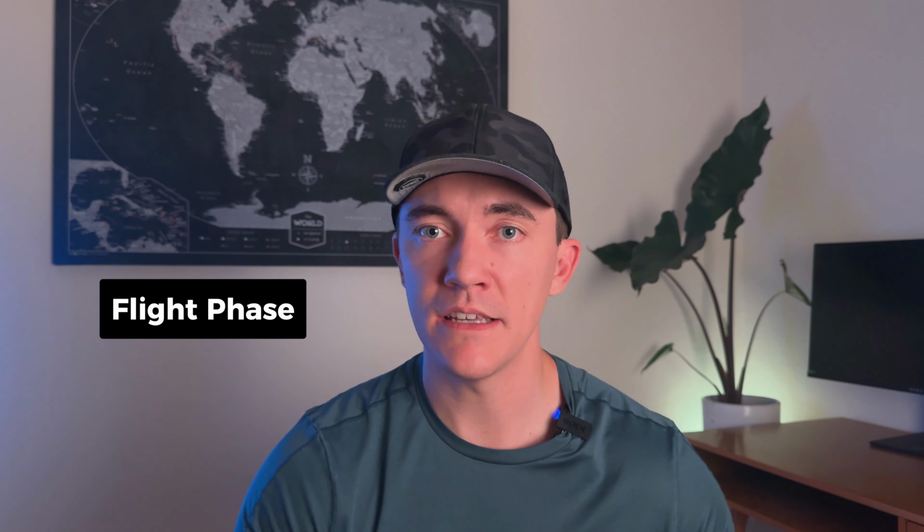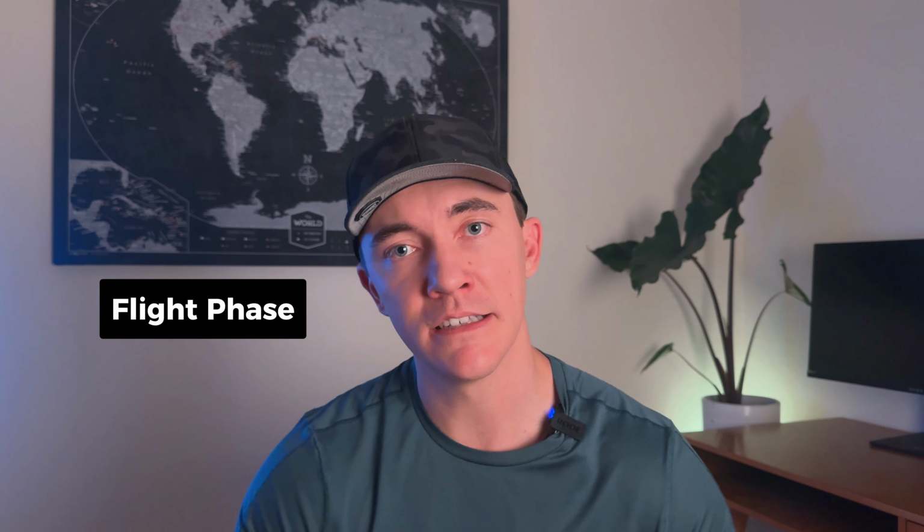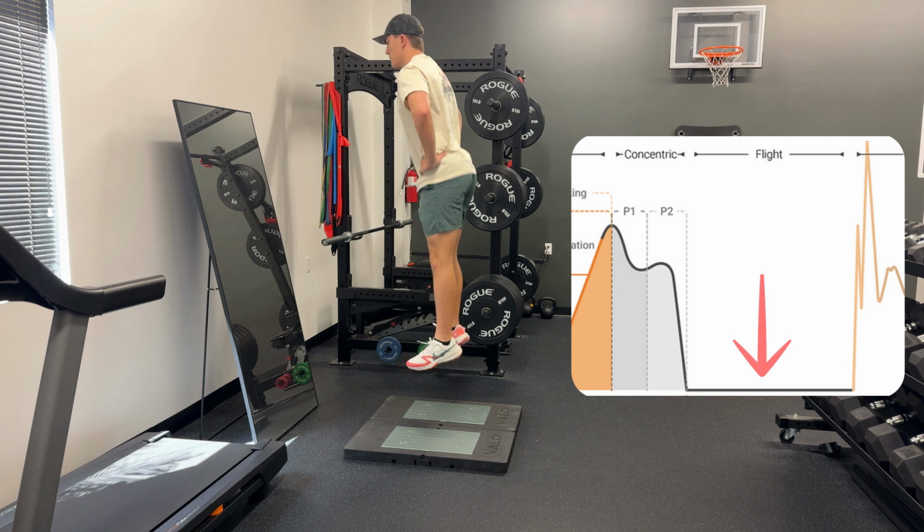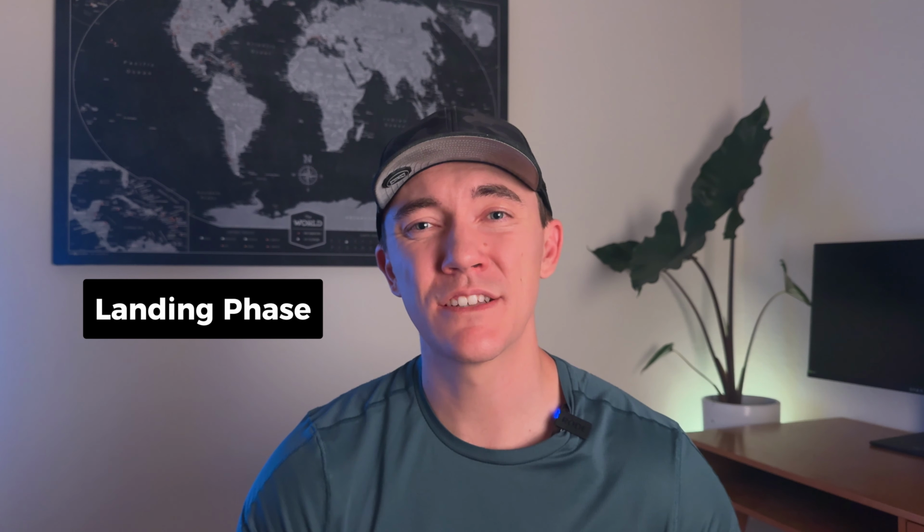As I'm sure you can imagine after talking about these previous phases, when you're in the air, there's obviously no force being put down into the plates. That's why you have this flat line where the graph bottoms out. It's because you're in the air, there's no weight being put into the plate, so it's reading as 0. The entire time that you are in the air and the graph is flatlined is what's called the flight phase. And our final phase is called the landing phase.